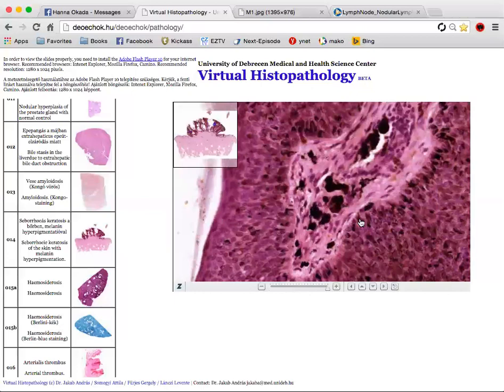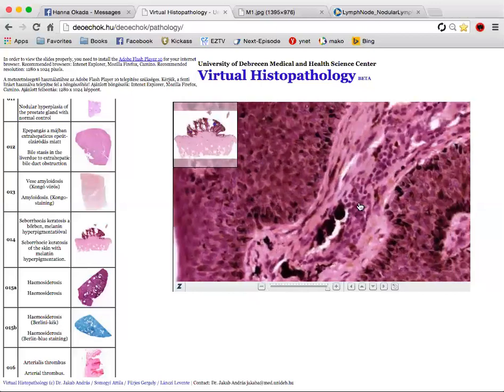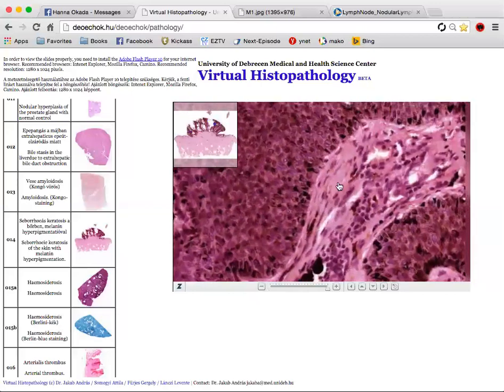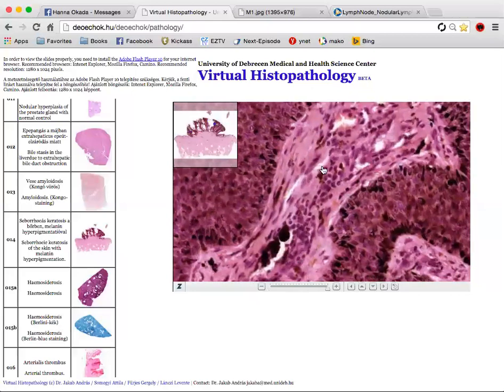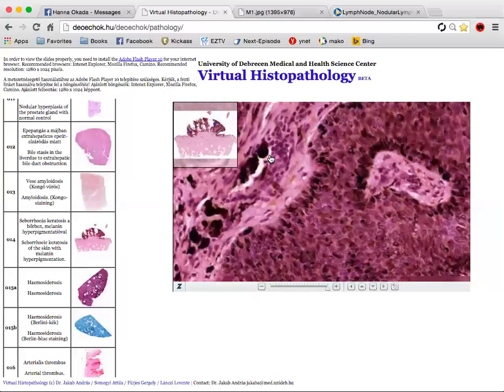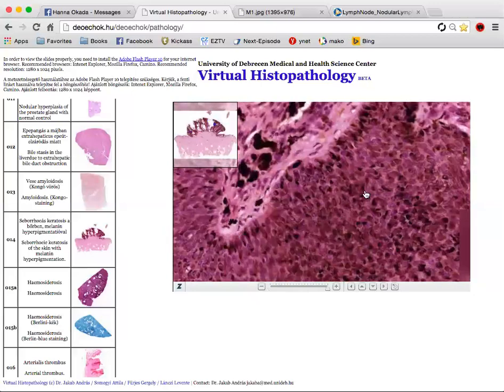Okay, and this is connective tissue, surrounded by the macrophages, this brighter area. This is connective tissue. This is like dermal projections into this. That would have small blood vessels that bring nutrients to the epithelium.